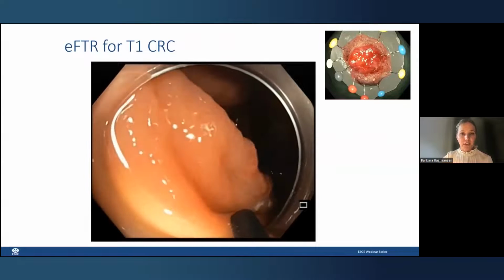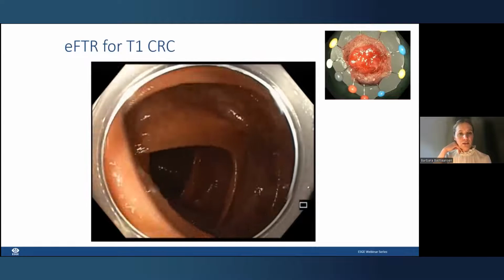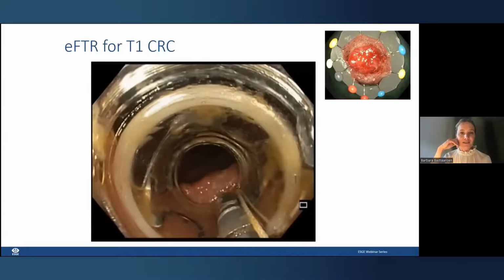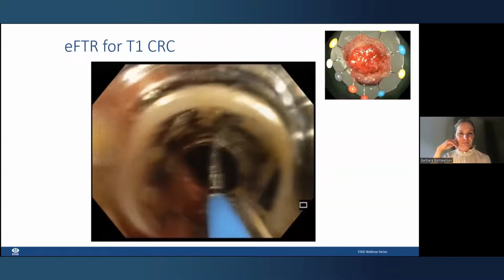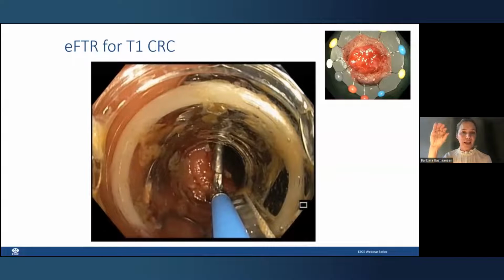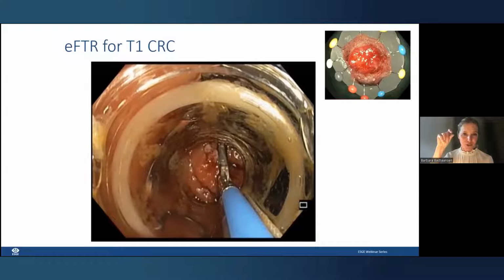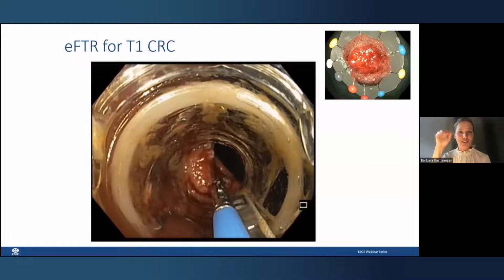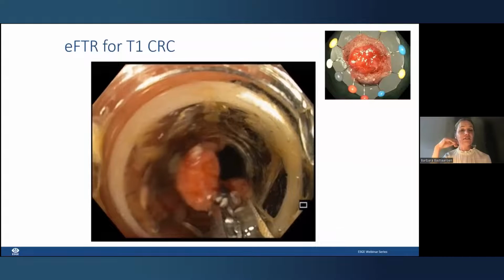So the markings, again, quite close around the lesion. It's running over the fold. So the markings really help to recognize, again, with this device on top. It's very important. We only open the grasper outside the cap because the diameter of the grasper is wider than the inner dimensions of the cap. And when you open the grasper inside the cap, you can dislodge the integrated snare. So only open the grasper outside, then start pulling.